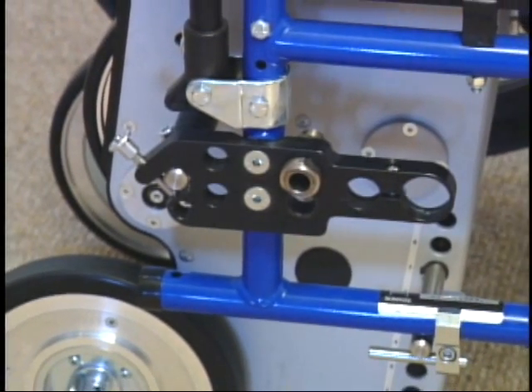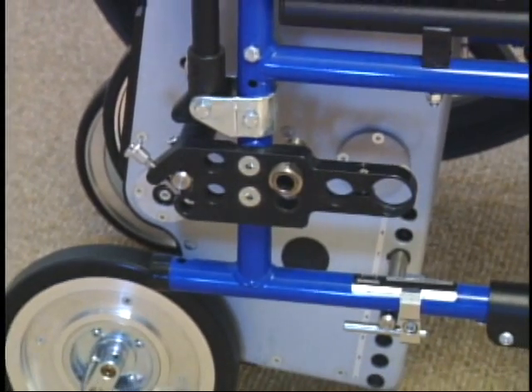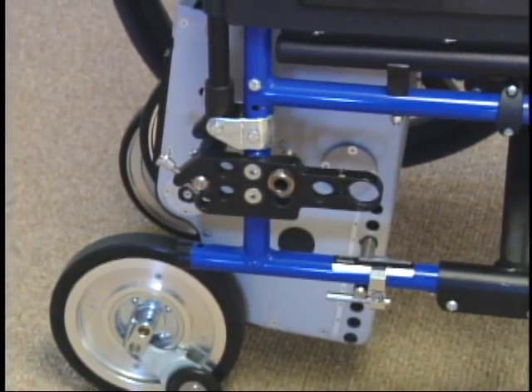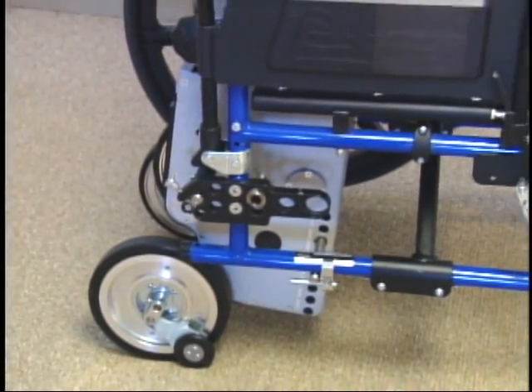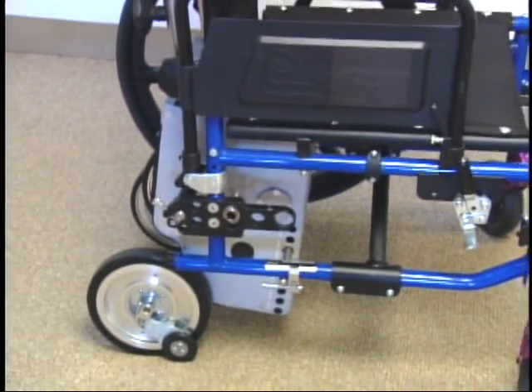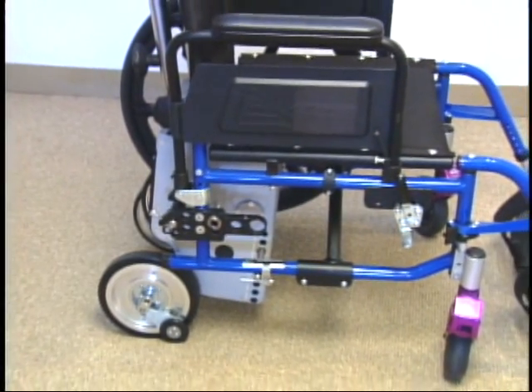A variety of brackets are available to convert manual folding wheelchairs into a portable stair climbing wheelchair. A certified sales agent carries out the installation. A wheelchair seating width of 16 inches or more is required to allow a custom conversion with brackets.